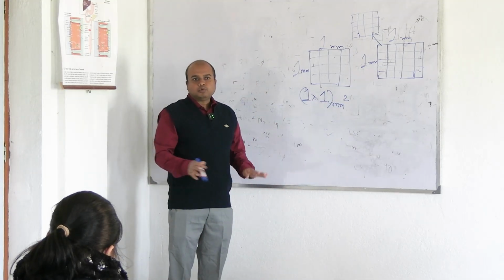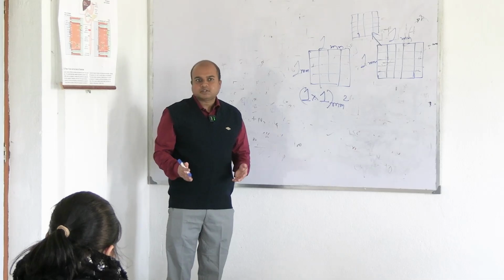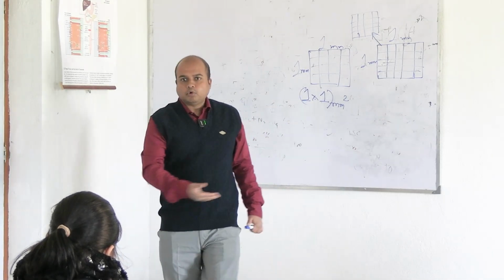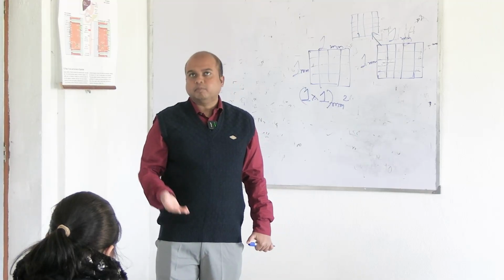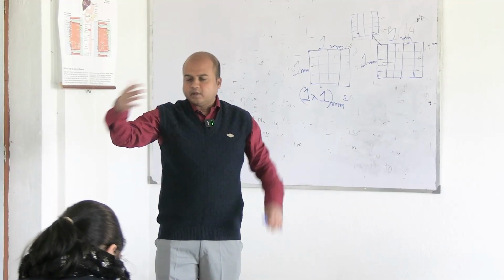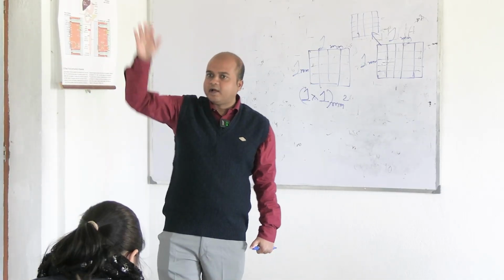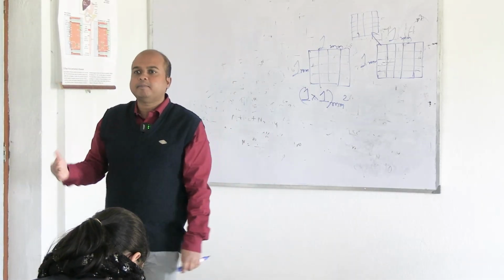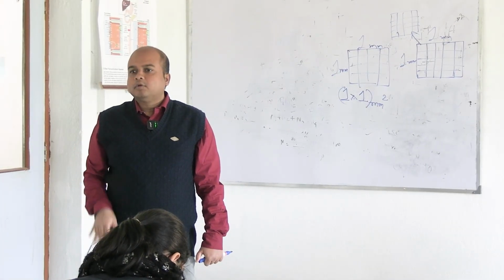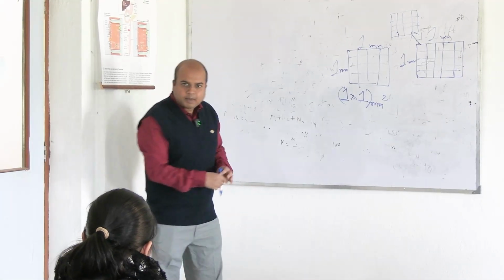And what we have told, although this is written in books, don't say volume of the squares, because squares are on a 2-dimensional surface. Like we told, the floor of the room cannot be a volume, the roof of the room cannot be a volume, it can be an area. But the whole room can be a volume as there is a height. So what is that height here, the third dimension for calculating volume? Yes, the space between the grid and the cover slip, so that is 1/10.